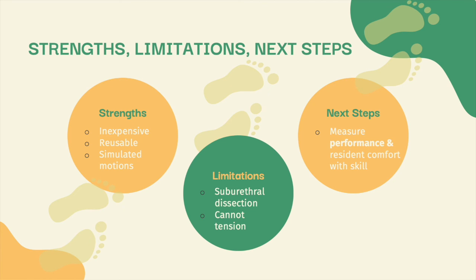Strengths of the model include its low cost, reusability, and ability to simulate muscle movements for the insertion process. Though the model does not teach the suburethral dissection or tensioning steps, this can be taught in vivo. Finally, we will be conducting a research study to validate the model's usefulness in helping resident performance and comfort with this surgical procedure.